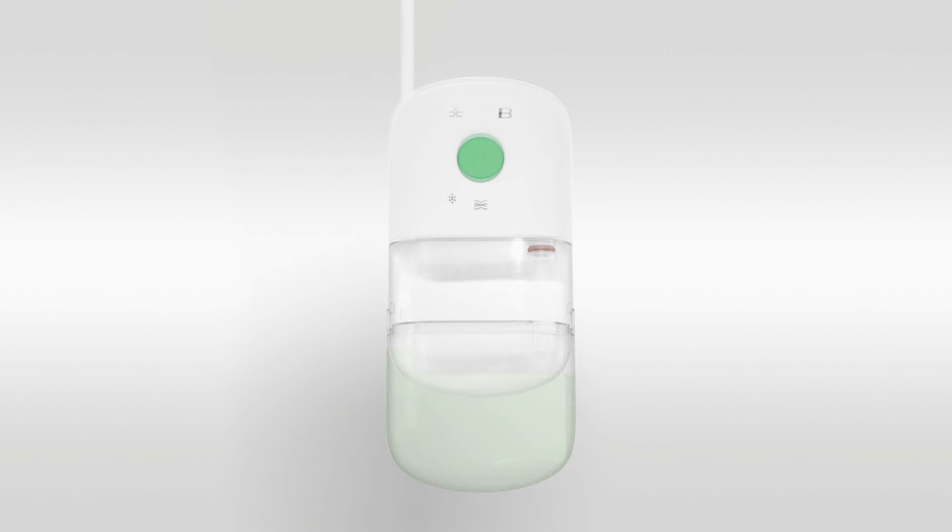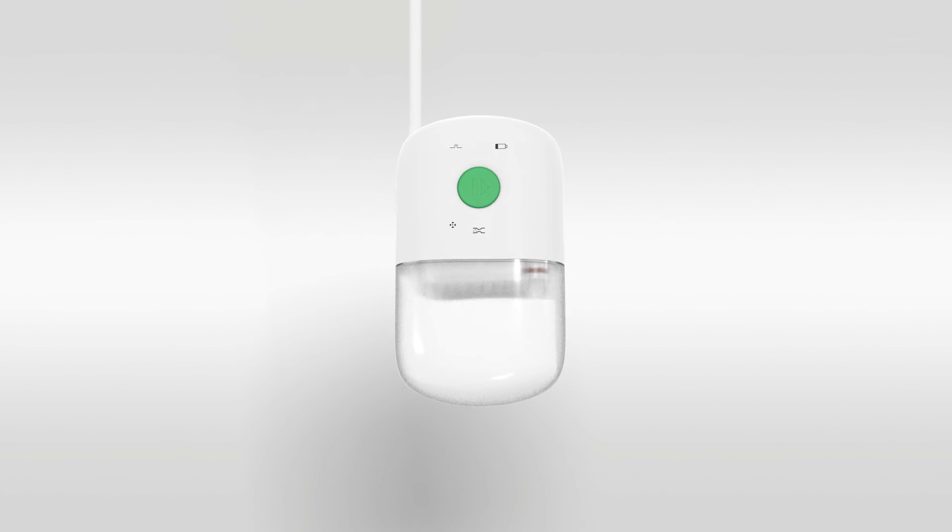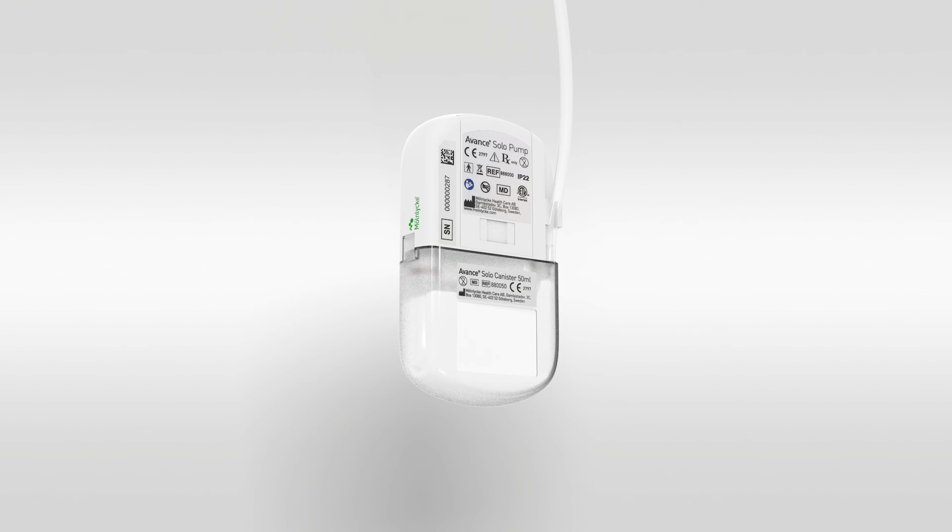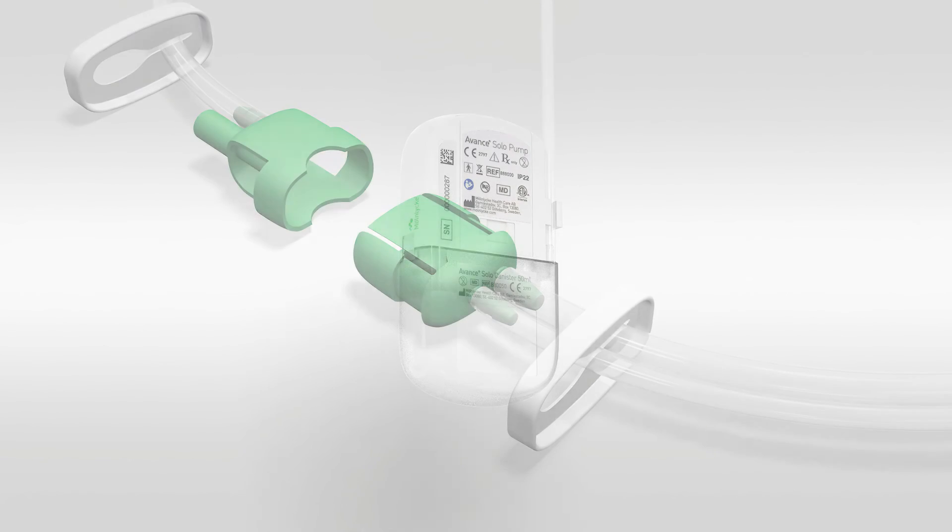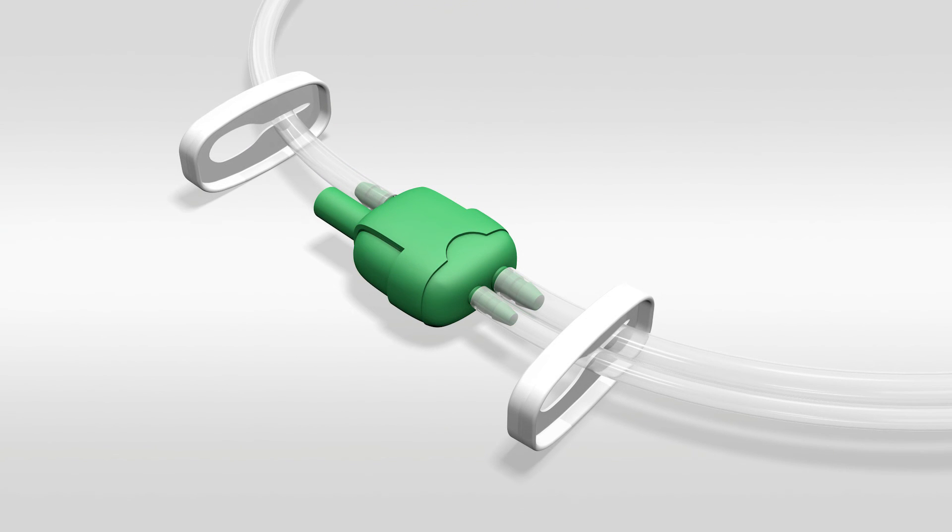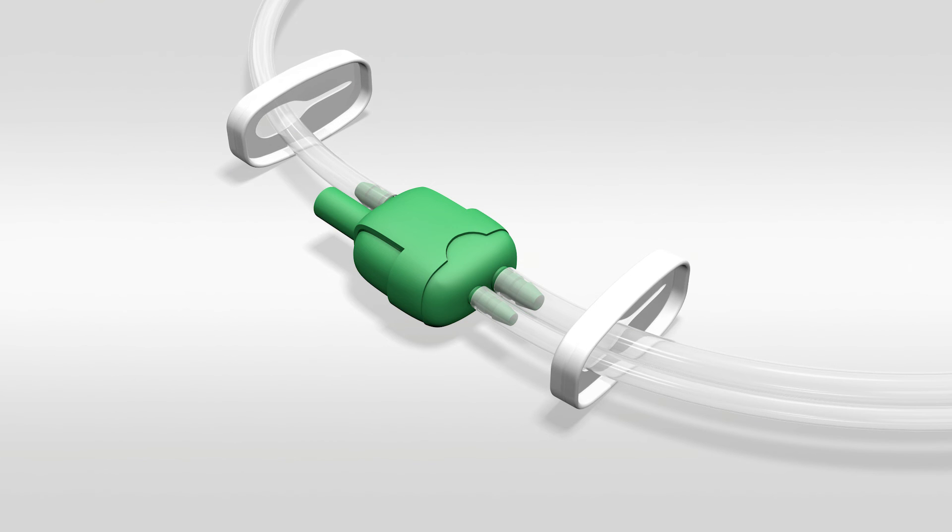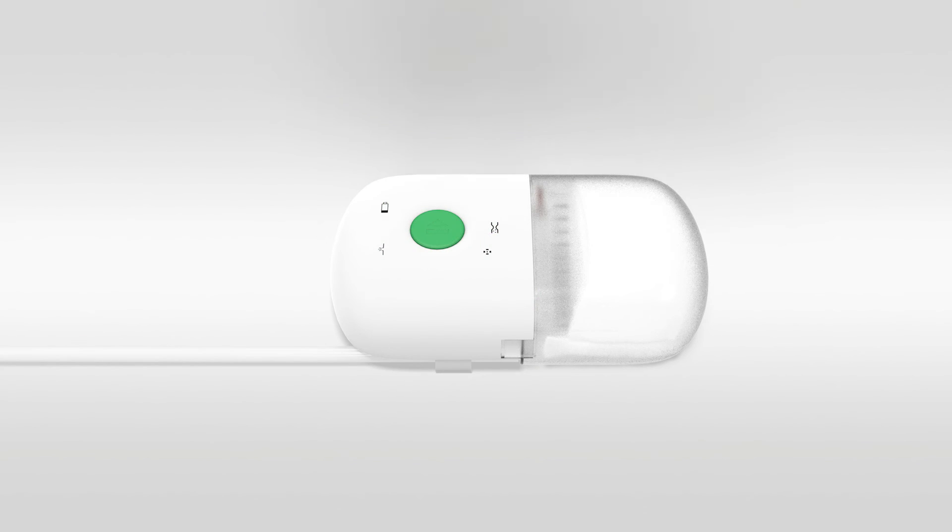To replace the canister, you repeat the steps at the beginning of this animation, making sure you secure the tubing in the pinch clamp at the back of the pump. Couple the two green connectors. Unclasp the two tubing clamps and restart the pump.